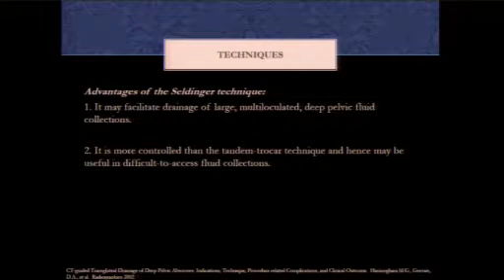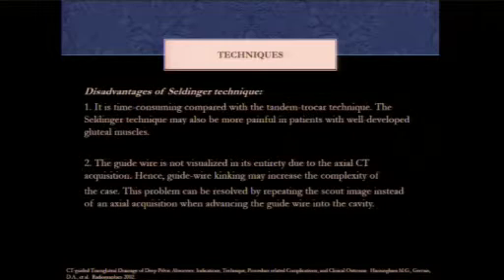As I mentioned, with Seldinger you have more control, and you can sometimes drain larger collections and deeper collections. It's more time consuming, and you don't always see the entirety of the guide wire when you're draining the collection.